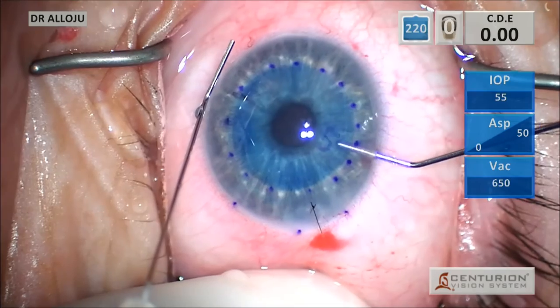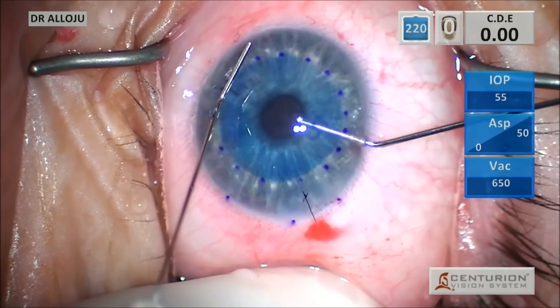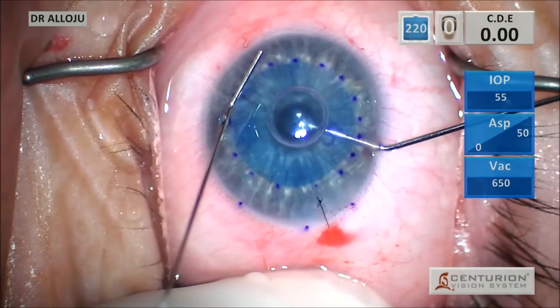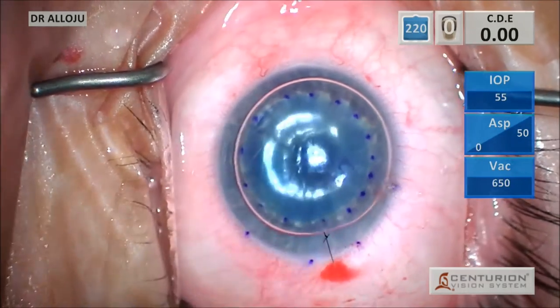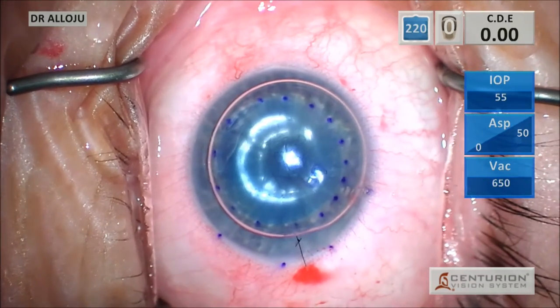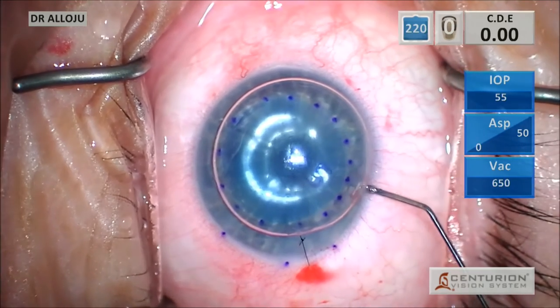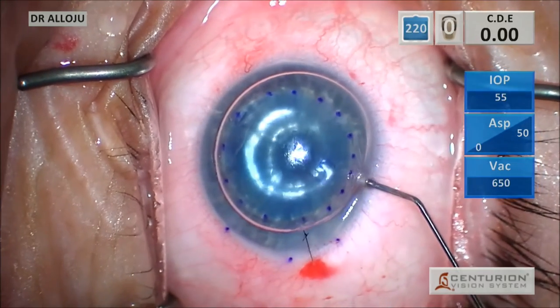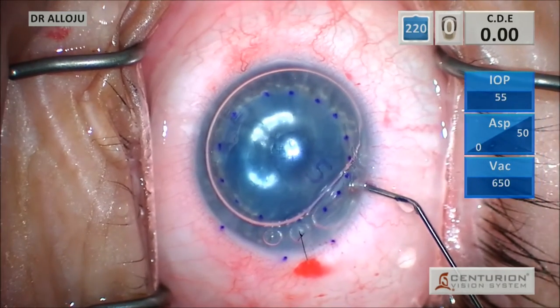And I'm getting the air cannula. You want to watch this step very carefully. Make sure you're sliding above the iris, underneath the graft, and slowly inject an air bubble. Once you've got your air bubble, you essentially want to go back in and do a full air fill. I do a full air fill at this stage for about 10 minutes.